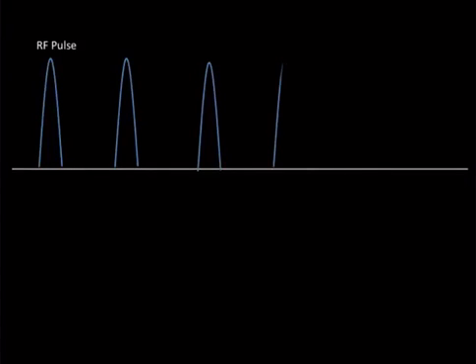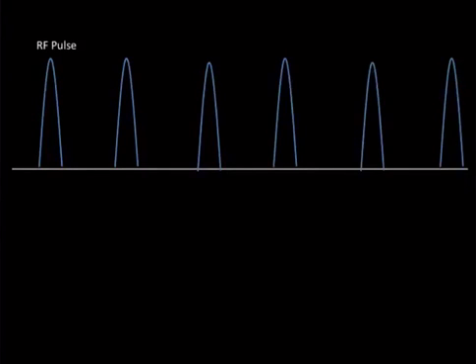Got our different RF pulses here. The time between the initiation of each RF pulse is referred to as the TR, or the repetition time. You'll hear that terminology. I'll use it throughout the lecture series as TR. What that actually is is the time between each pulse.